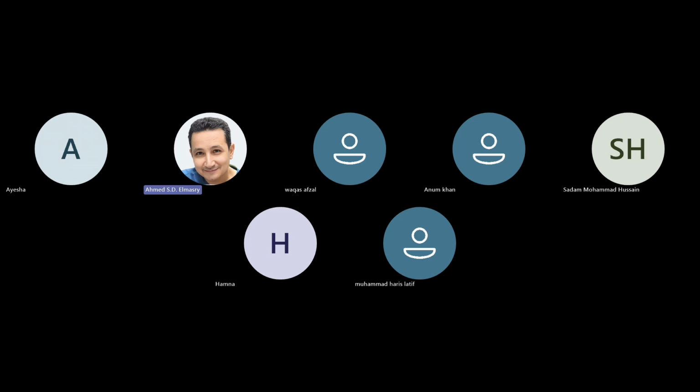If it went to the brain, it might lead to stroke. So the patient might get harm, but the harm from helium is less than from other gases. That's why they choose helium: because it's a light gas, the inflation and deflation happen very fast, and the body can absorb it very fast. So the harm from the gas embolism might be very small compared to other gases.